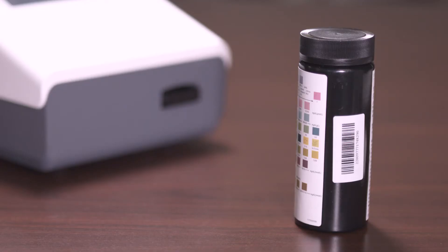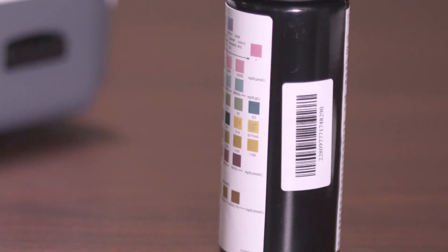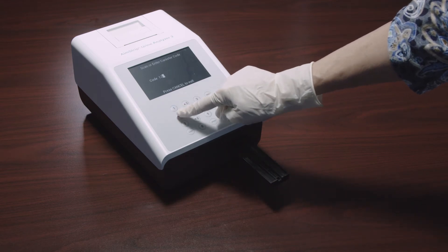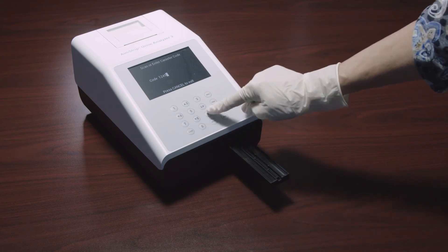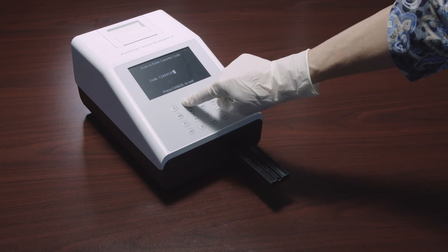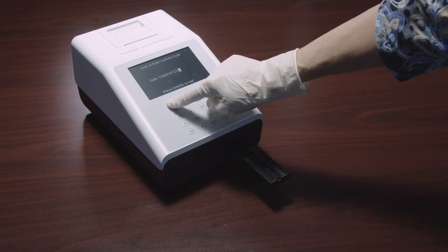When using a new canister of strips, the analyzer will request that a canister code be entered. The code can be entered manually from the keypad or scanned from the barcode reader if installed. At first startup, the strip holder will fully extend and the screen will prompt you to scan or enter the canister code. If the canister code is correct, the analyzer will go directly to the test screen; if you press Cancel, the analyzer will return to the initial screen.